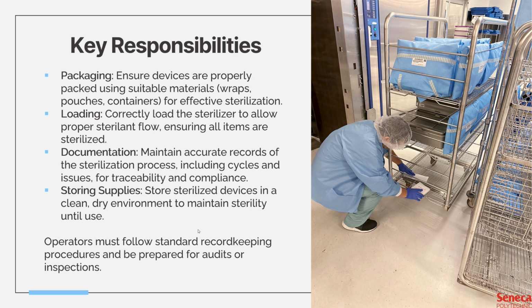And of course, as the operator, you must also know how to store these supplies properly. So after sterilization and proper drying, they have to be stored in a clean, dry, and controlled environment. Improper storage can lead to recontamination, negating the sterilization process. So let's say you didn't let the cycle cool down enough. You decided to pull out everything and put it away in the storage.